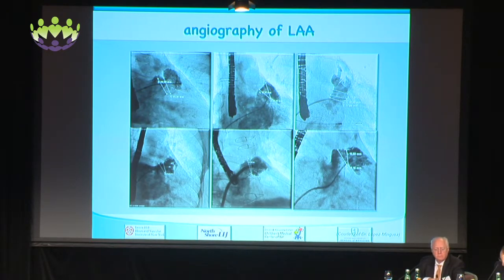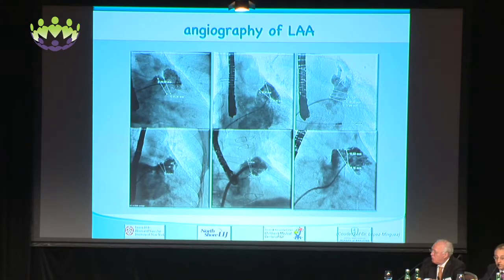This is based mostly on the images that were obtained from a CT, but the way that it is being used is by angiographers using a fixed projection, whether we know beforehand or not that the appendage is facing anterior or posterior. We don't, and we make this classification.